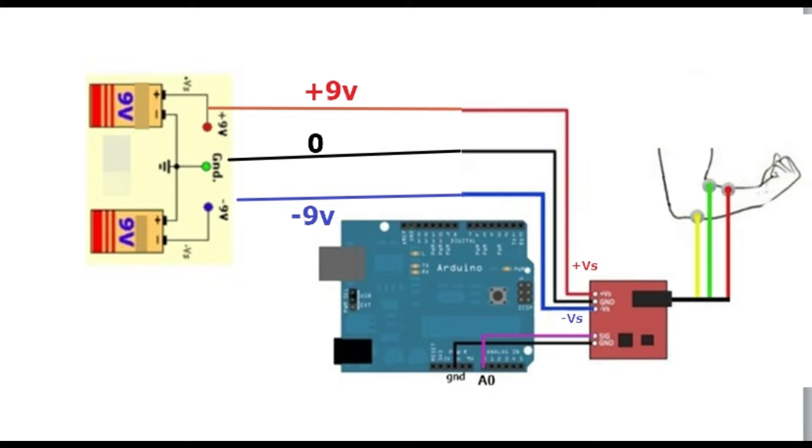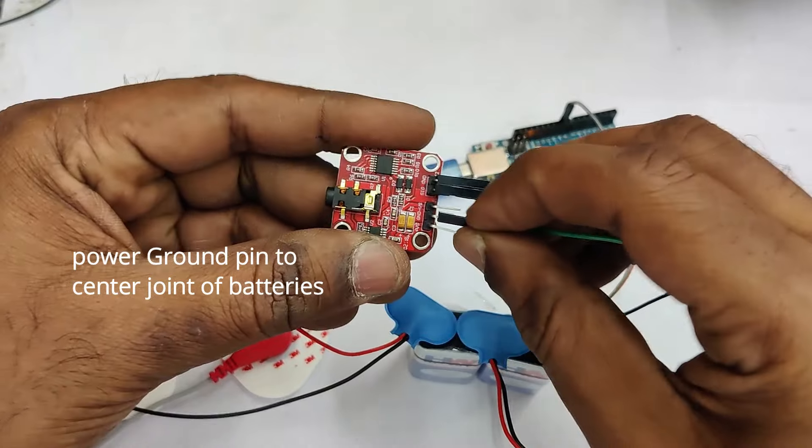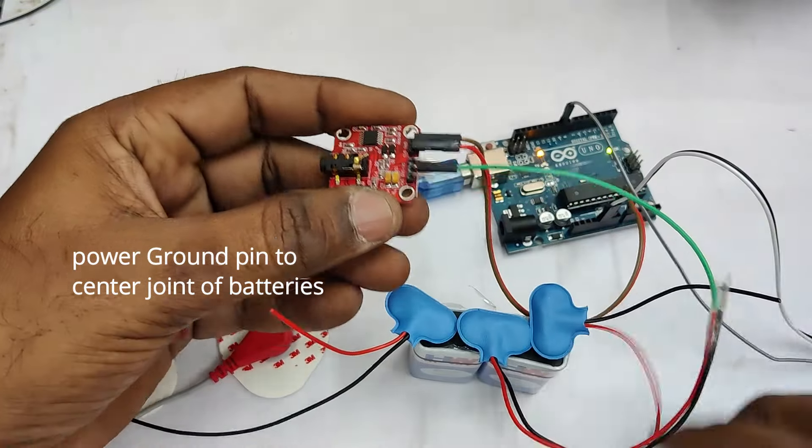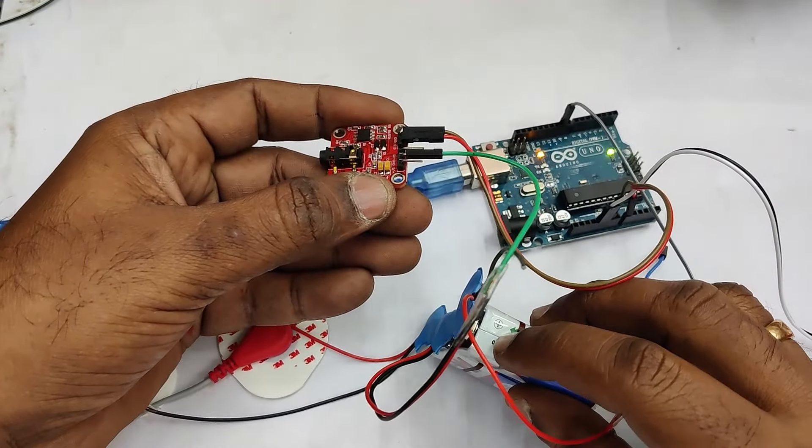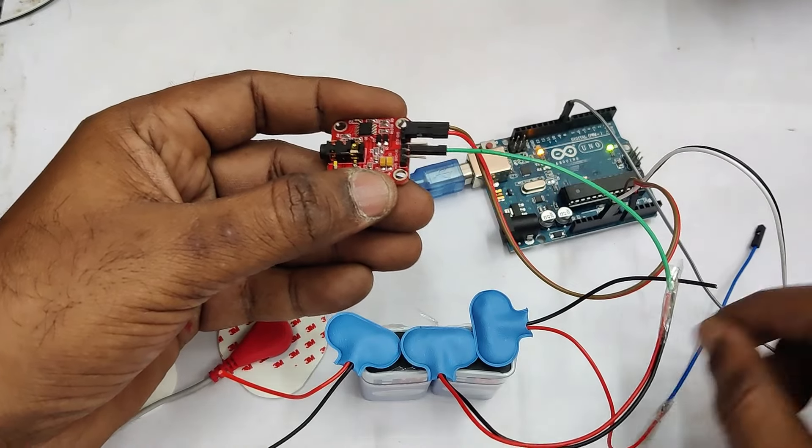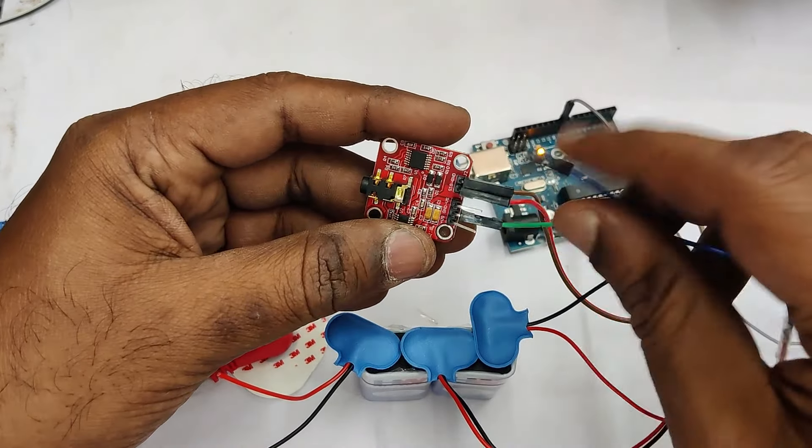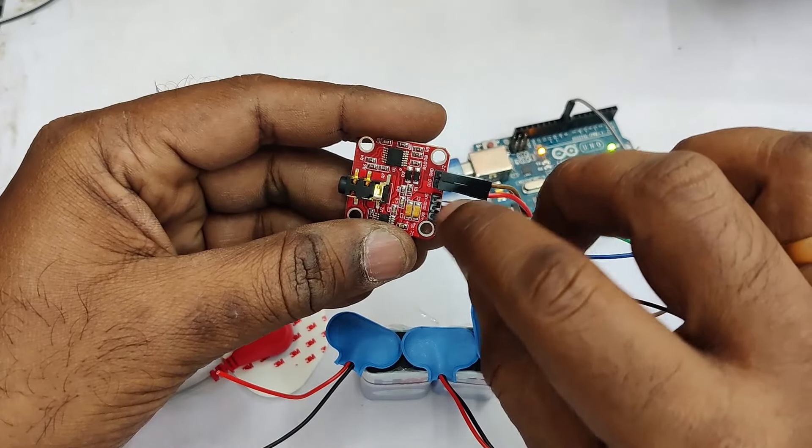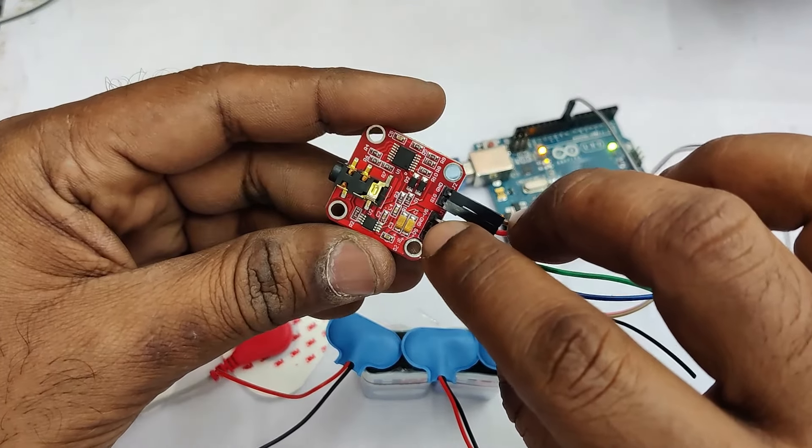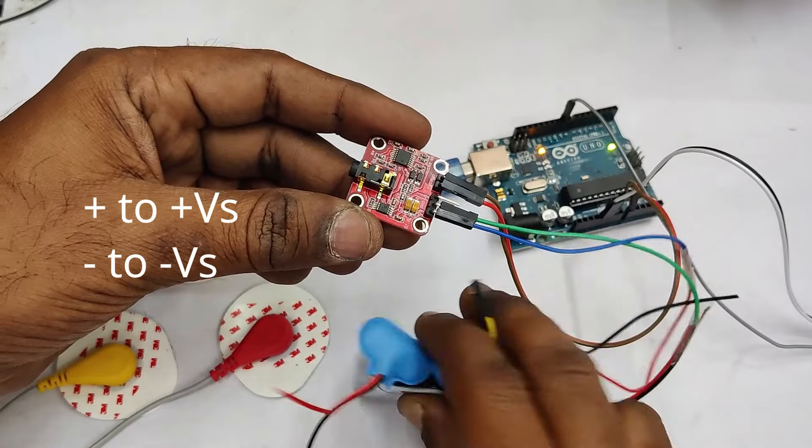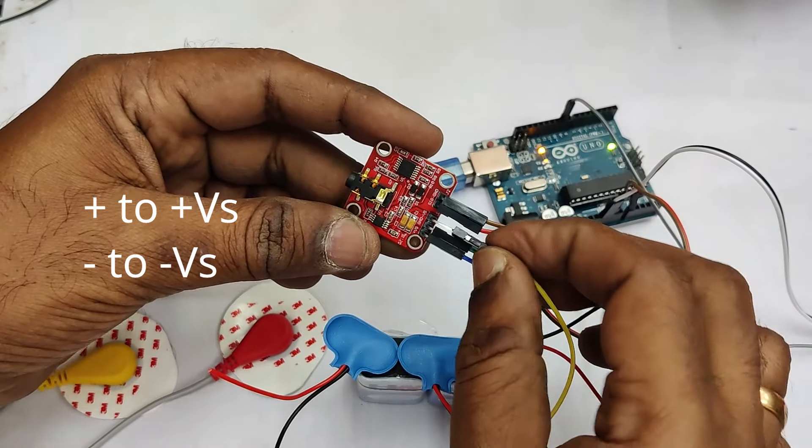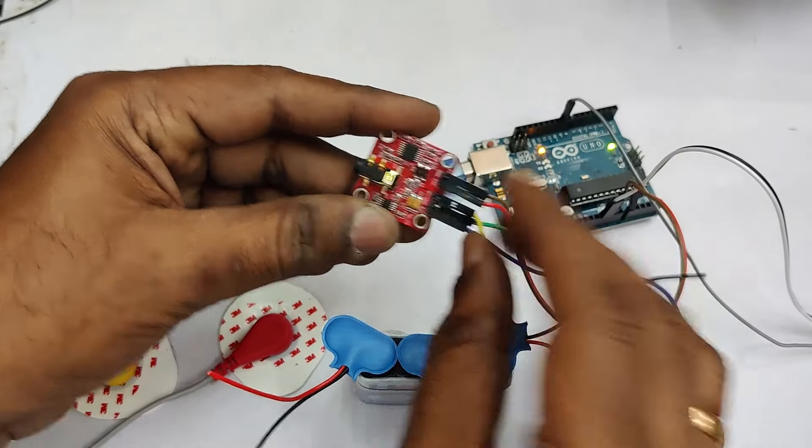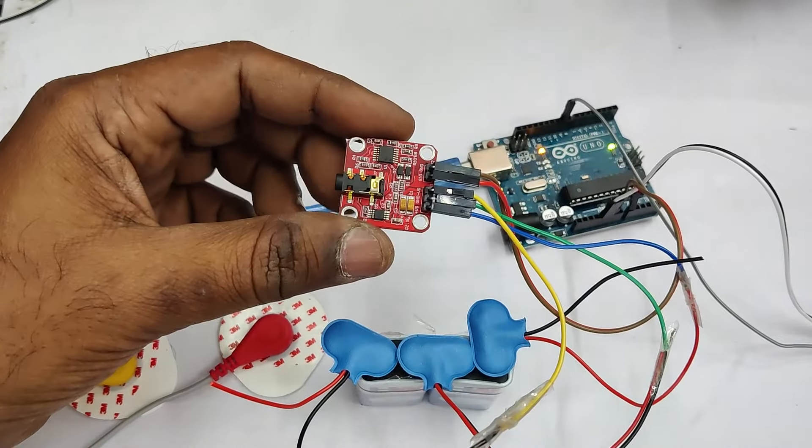The three pins are together on the EMG board. The power ground, that is the center pin, is connected to the center pin of the dual batteries and plus VS to plus 9 volt and minus VS to minus 9 volt. Take caution to connect only the plus VS to plus and minus VS to minus. Do not reverse it.